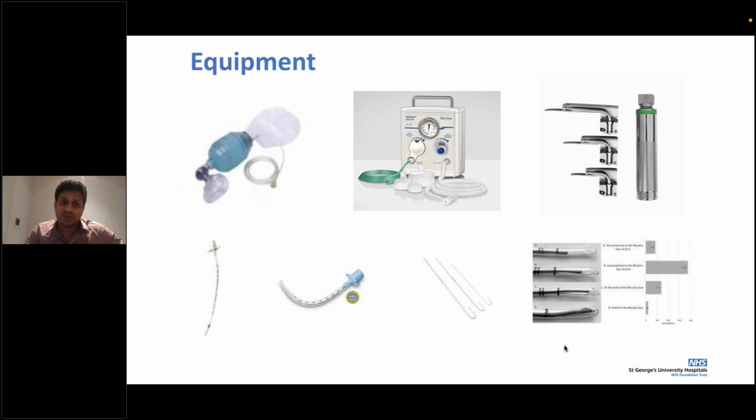And there is a stylet that is inserted within the endotracheal tube. Now, a stylet within the endotracheal tube is not always necessary, but most neonatal units have got into the policy of introducing that. In that case, it's important that you've prepped your endotracheal tube absolutely correctly. The stylet almost never should be crossing the tip.